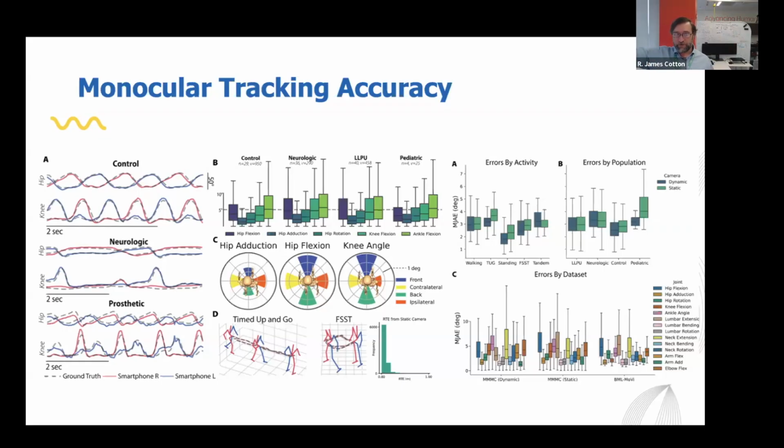So we have this whole database-backed infrastructure. One of the stages in the pipeline computes the bounding boxes and then lets you say, well, bounding box 3 is my participant, or bounding box 7, or even, if they got split, bounding box 3 and 19. We do that to have a human review who is the person we want to analyze and annotate it. If there's only one person in view, then you can do it automatically.